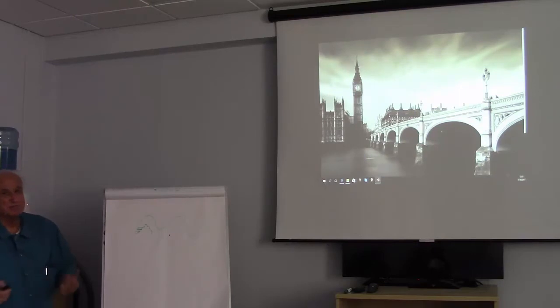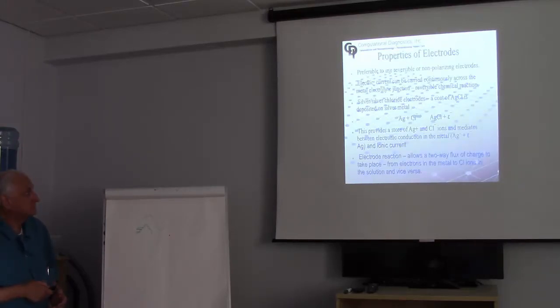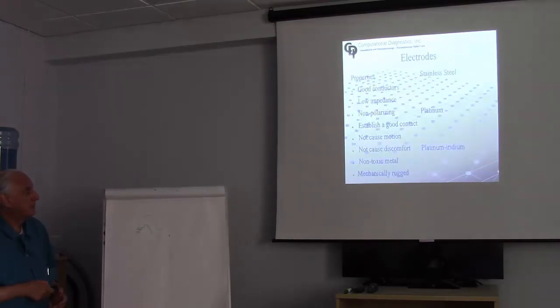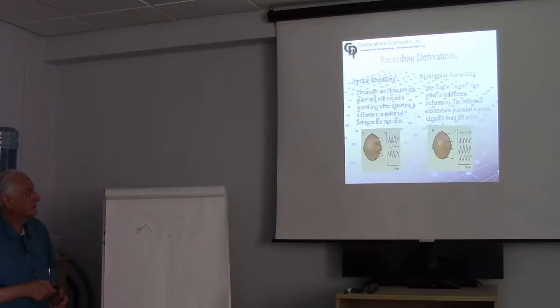People talk about bipolar and monopolar recording. You're always recording in a bipolar mode. The reality of recording voltages is it's always bipolar. You've always got to record between 2 points. The question is how far apart are the points, and that's the idea of bipolar versus monopolar.